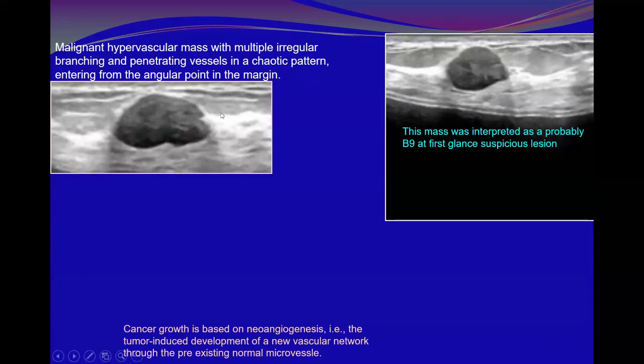This is also my patient. If we look at the gray scale here, from the first glance we might say it might be a fibroadenoma. It looks circumscribed, but I was not happy. This is a patient having an implant. This black area is the implant, and this is its capsule. She had a palpable abnormality. When I looked at this, I was not happy. There are some angular margins. And look here, when I angulate, I can see this angular margin again.